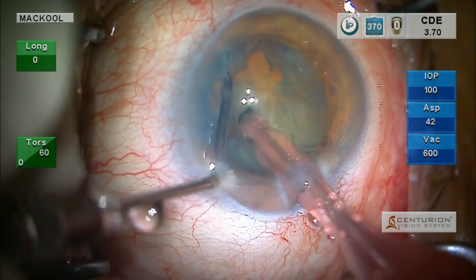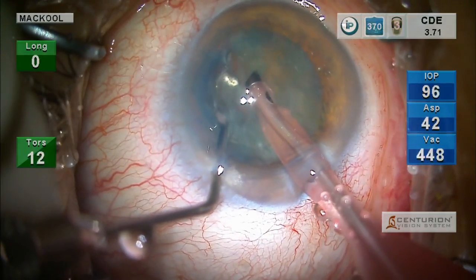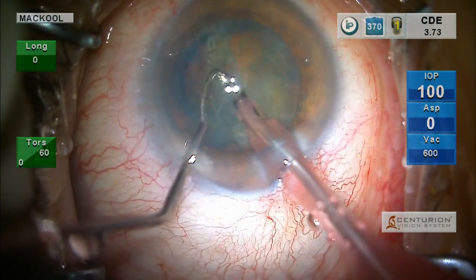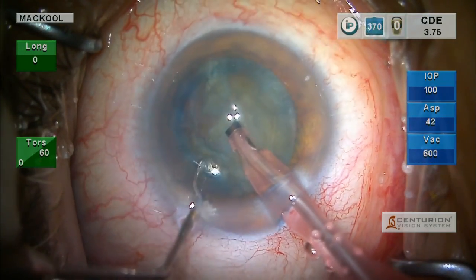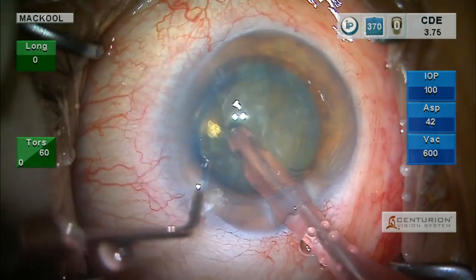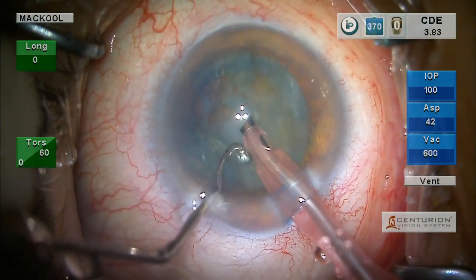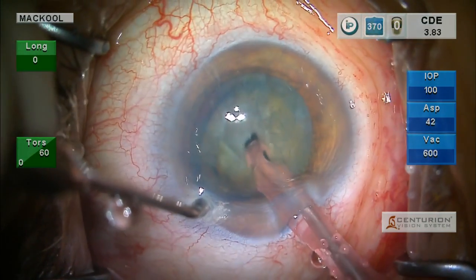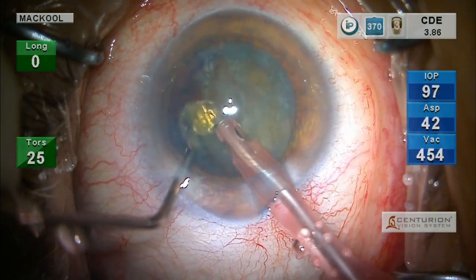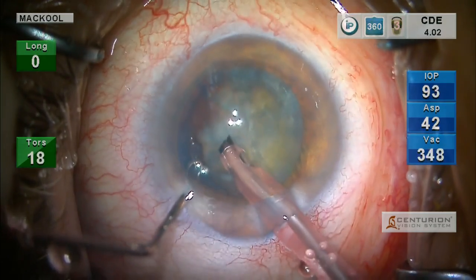I'm going to chop some more here. One of the things I'm noticing is that the nucleus tends to be a little bit retro-displaced from the capsule. Does that mean the zonule is lax? Maybe. I'm going to see if I can get over here and chop upward on this side — I call that a back crack. One thing I like about back cracks is you don't have to rotate the nucleus to do it.